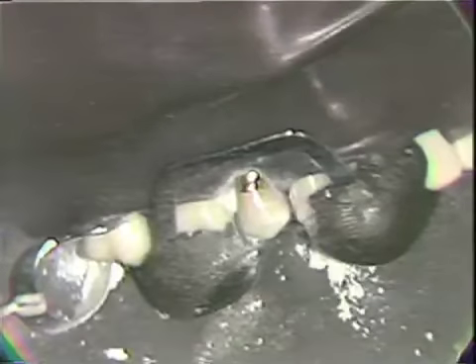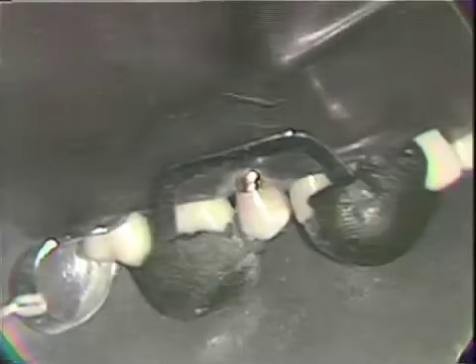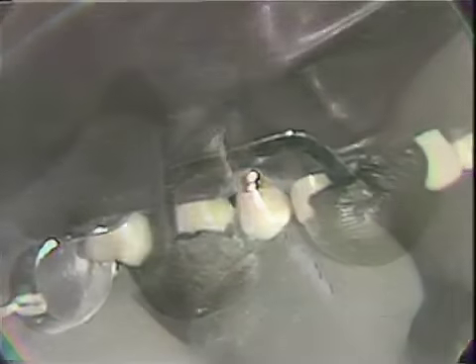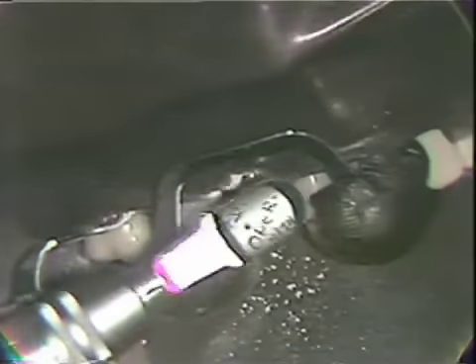We'll just cleanse the area with the airstream and move now into the use of the tin oxide as an abrasive material. Again, rather lightly. Air continuing to play across this area.